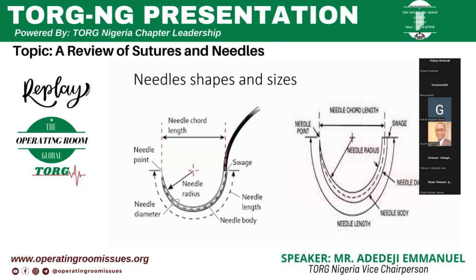In terms of the size of the thread, we know that we have from 10-0 to the commercially available ones I know very well. We have 8-0, 6-0, 5-0, 4-0, 2-0, 0, and we have 1 and 2. At least these are the commercially available sutures that we use.